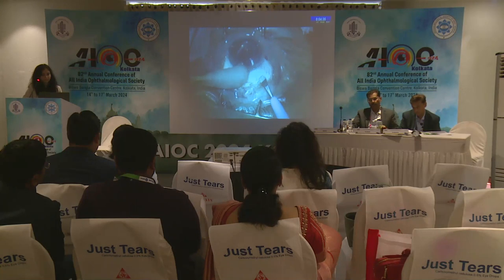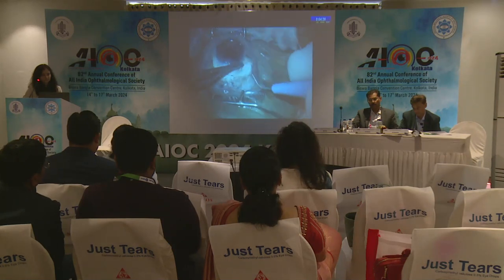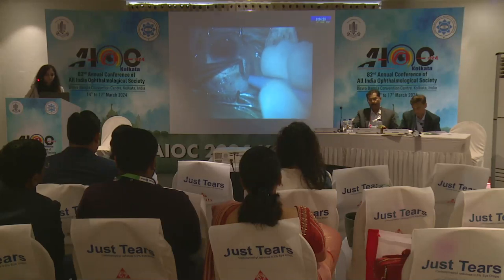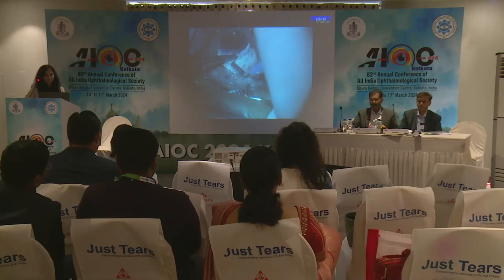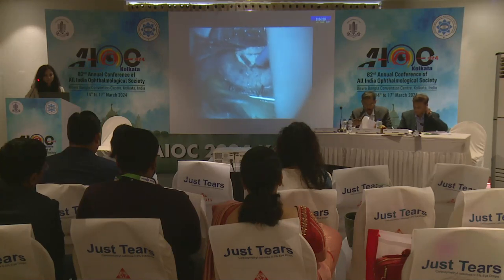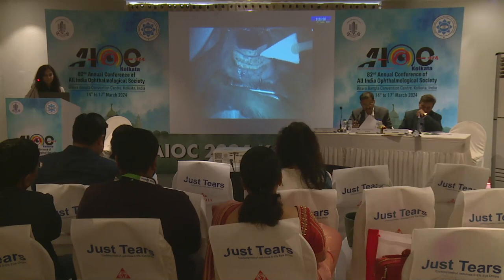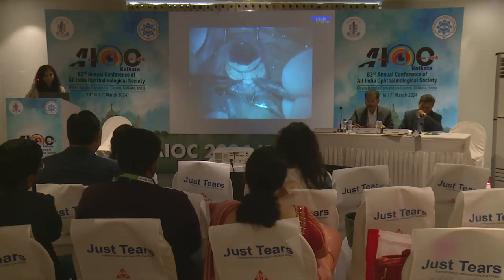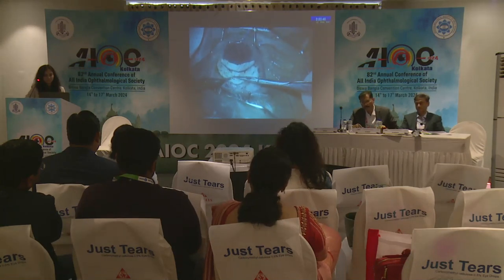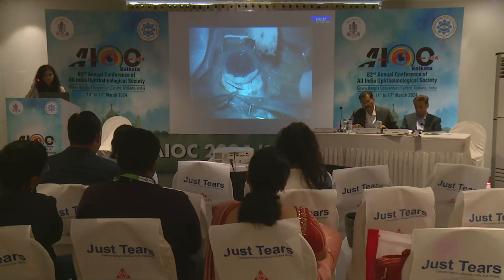Initial incision in sclera is 3 mm from the limbus and a laminar scleral flap is created with the help of a crescent. Transillumination is done to identify the area of disinsertion of ciliary body from the sclera. Full thickness incision is created 1.5 mm from the limbus with the help of a surgical blade and extended on both sides with the help of scissors. Note a gushing fluid sign in the suspected cleft area. It is an indicator of a fluid-filled cavity in the supracoroidal space consistent with a cleft.